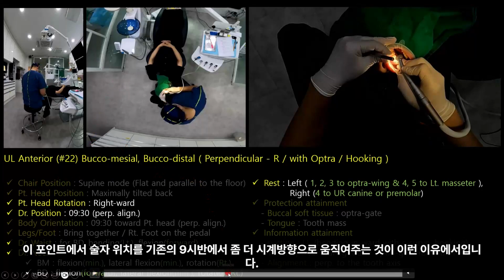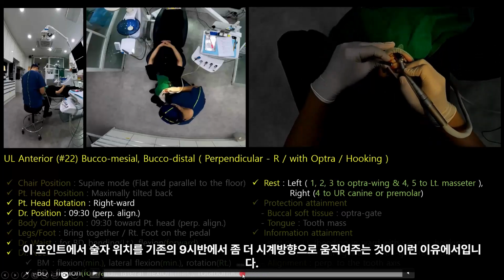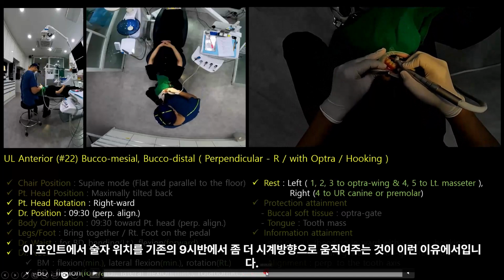Now, let's observe this. At this specific point, we will shift the operator's position from its initial 9:30 o'clock setting and incrementally move it further in a clockwise direction. Let's review this once more. This is precisely why you should move it in a clockwise direction.